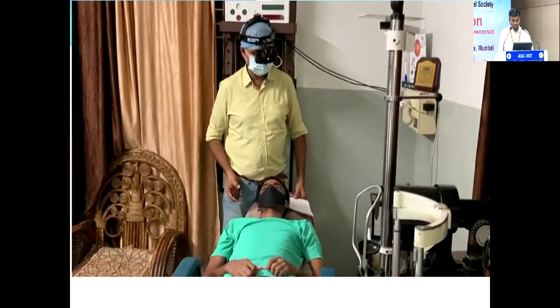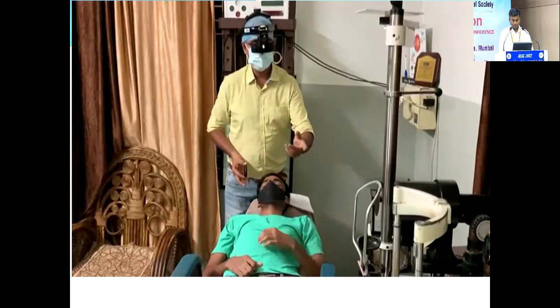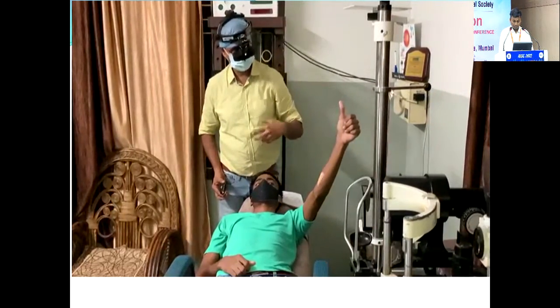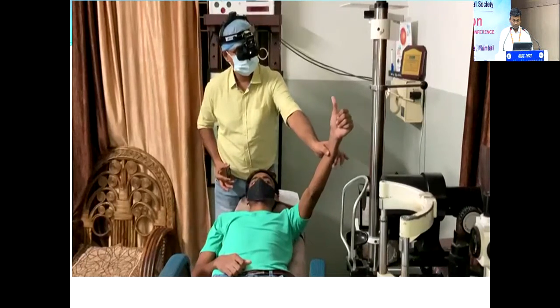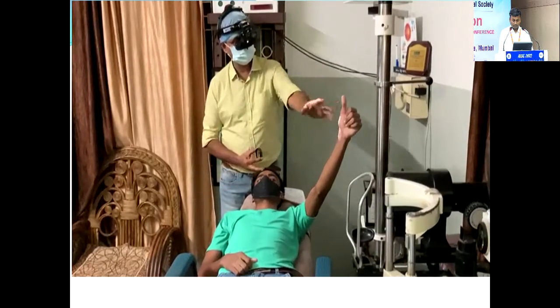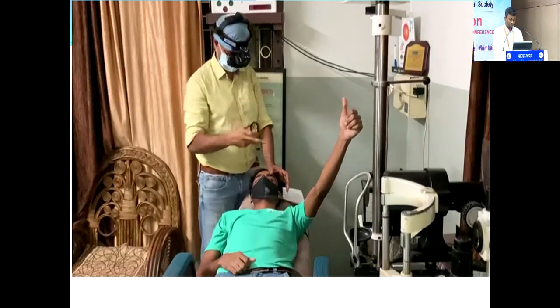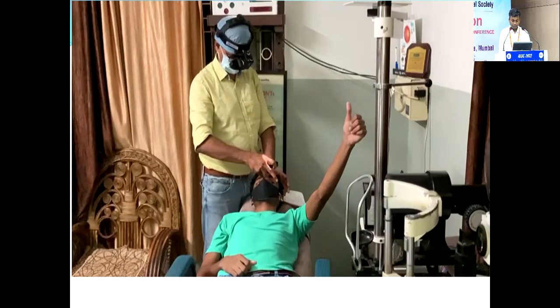The whole concept is, suppose when you see the patient, you ask the patient to raise his hand and look at his finger. This is done because with the bright light he won't be able to see his finger, but he will have this spatial orientation of his finger, so he can focus it properly. And when you see the patient is focusing there, you place your condensing lens. Now the concept is whenever you use this lens, this finger plays as the fulcrum or pivot. With this you move your lens.